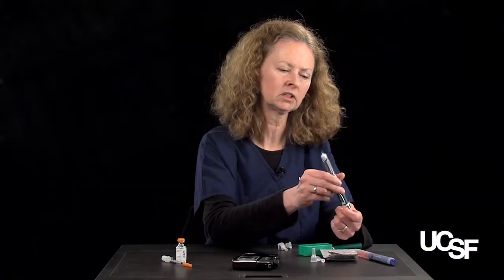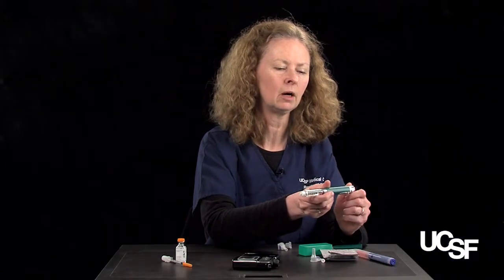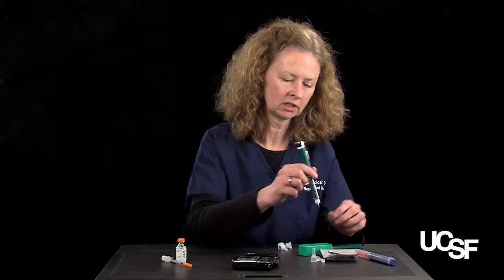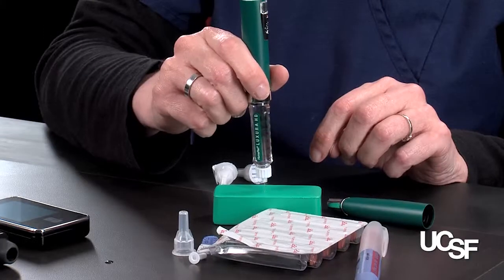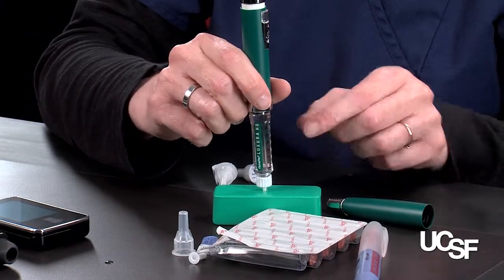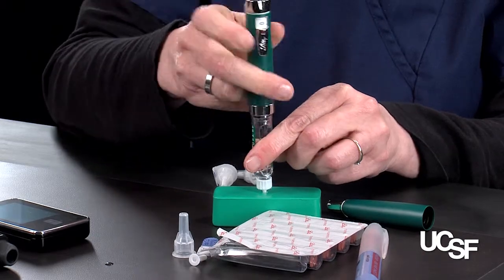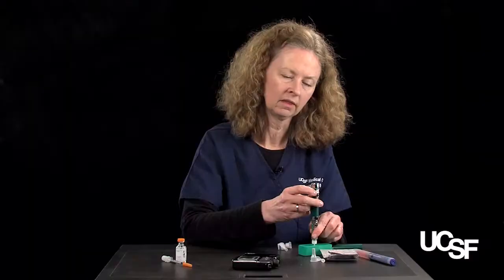So I can count the clicks, but I can also look to see how many units I have. So I should have 2 units. We inject at a 90-degree angle, straight in to the skin. Push down on the plunger end. That brings us back to 0. Then we count to 10.